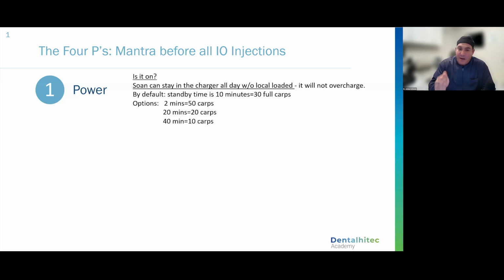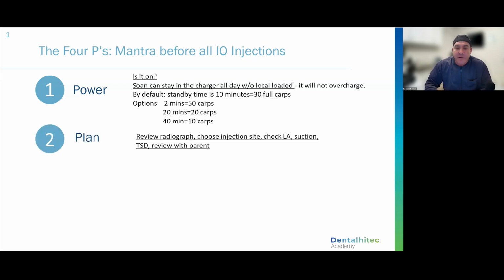Okay. So I come into the room, I sit down, I'm in number 1, I'm going to make sure that unit's on. If it's been sitting, the unit may switch to turning itself off. The times are set. You can actually change the times. I just keep whatever standard.